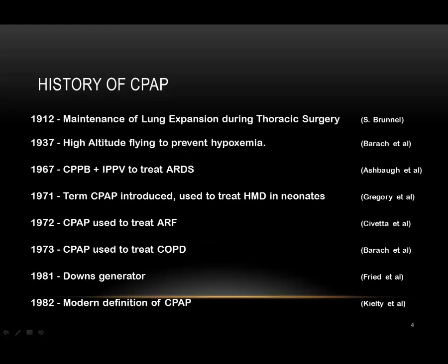This slide shows the history of CPAP. It was initially used all the way back in 1912 and used throughout the 60s and 70s to treat acute respiratory failure and COPD. While its modern use with a mask has occurred since 1982, it really wasn't introduced into EMS until the early 2000s. Some agencies today still don't utilize CPAP.